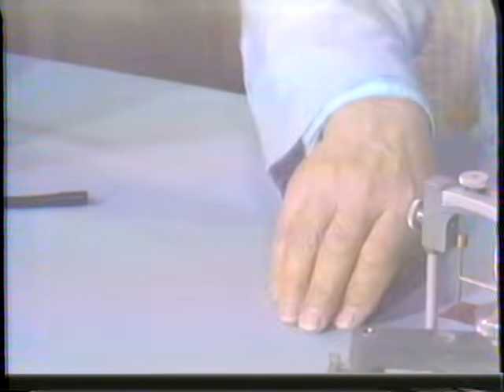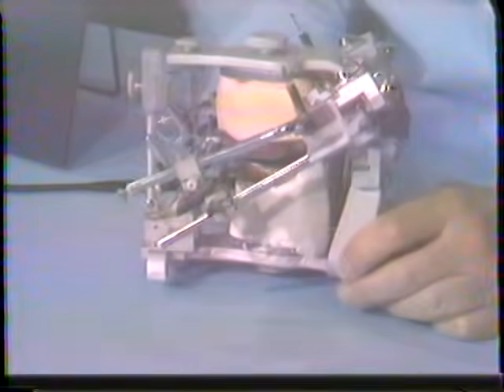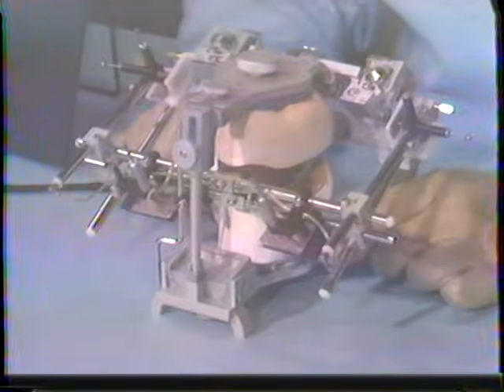Now we can go a bit farther in terms of jaw relation records and make a pantographic tracing. This is going a little bit far for complete dentures because of the instability of bases and the soft tissue displacements. Actually, a pantograph is much more applicable with the natural dentition, when we restore the natural teeth, fixed partial dentures, for example, and so forth.